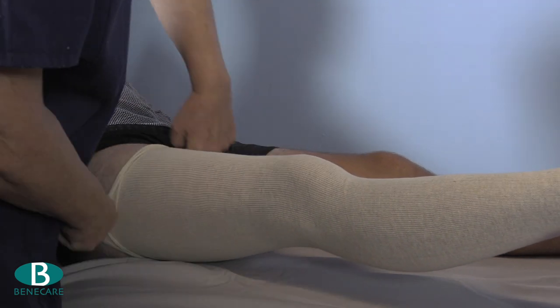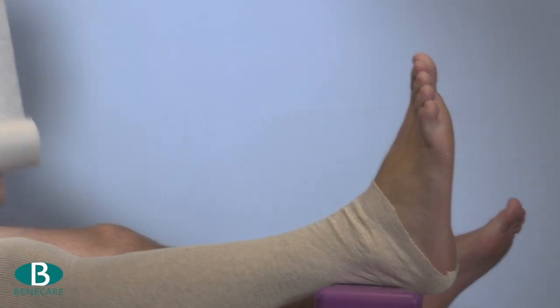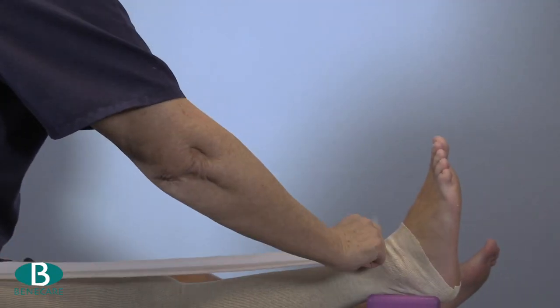Roll the first layer of stockinette into a doughnut and apply it onto the leg. It should fit from the ankle to the groin.